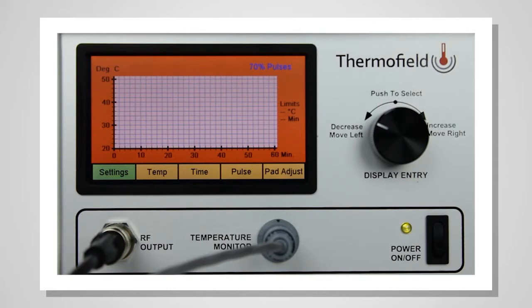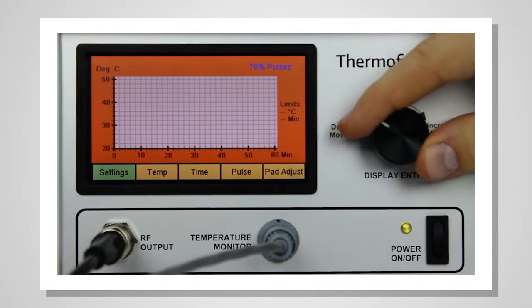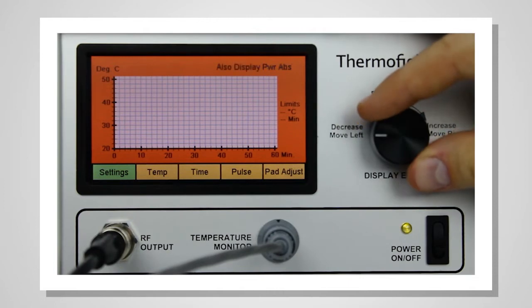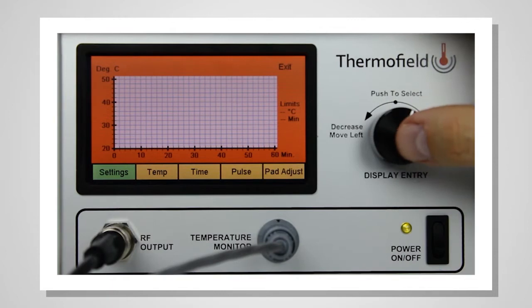The advanced settings include pulse percentage, pulses per second, megahertz, watts, and calibration settings. When you're finished, turn the knob until the display reads EXIT, and push the knob to exit.